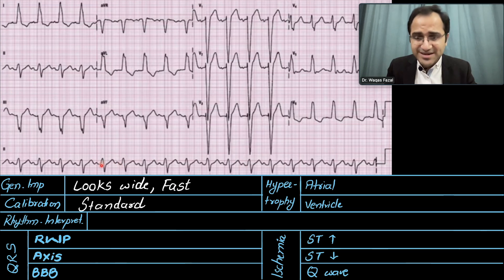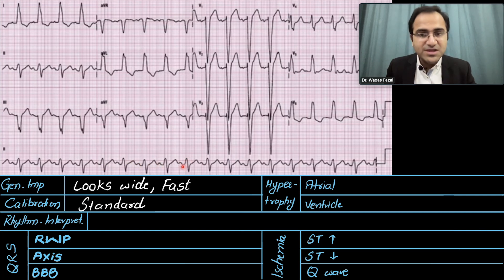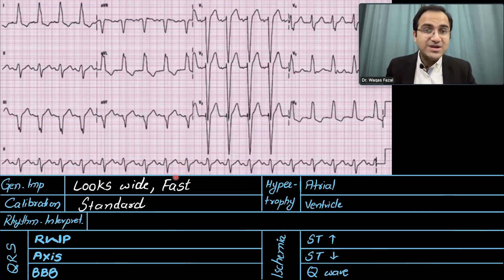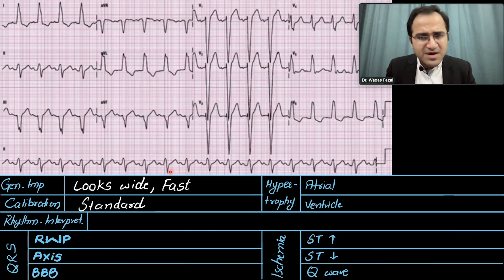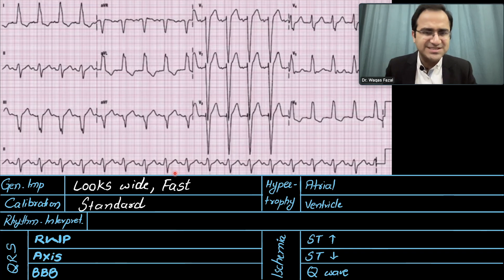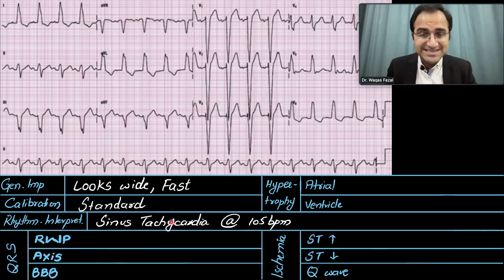Looking at the rhythm: P waves are present and are followed by QRS complexes — the P waves are married to the QRS complexes, so this is a sinus rhythm. Calculating the heart rate by counting large boxes between the RR interval: we have just over 2 large boxes, giving approximately 105 to 125 beats per minute. Sinus tachycardia at the rate of 105 beats per minute.